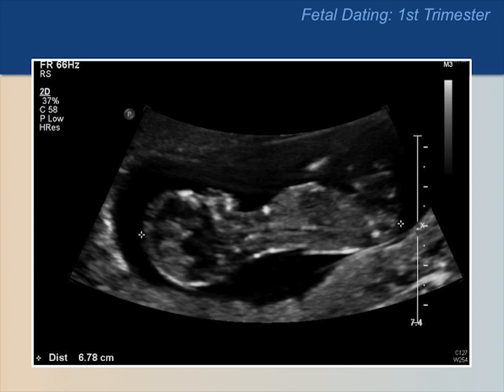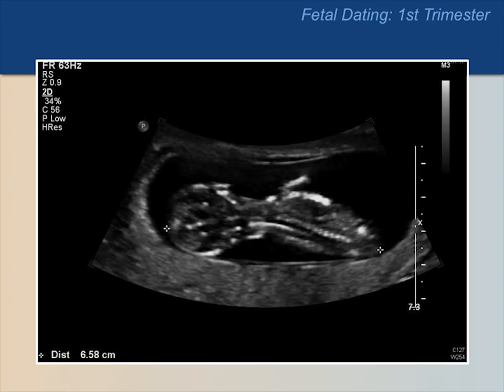The answer is that the fetal position is too extended to accurately measure the crown rump length. There is a slight profile because we can see a portion of the face. The calipers were placed correctly. Please pause the video again to invite a volunteer to assess fetal position, profile, and caliper placement.